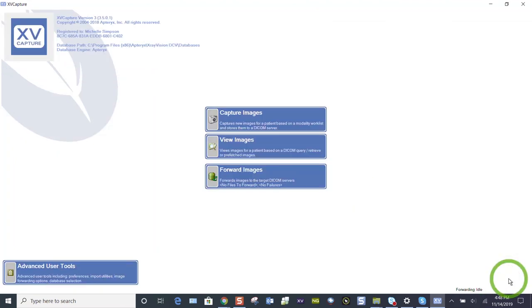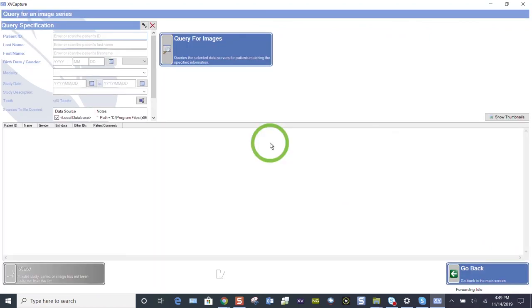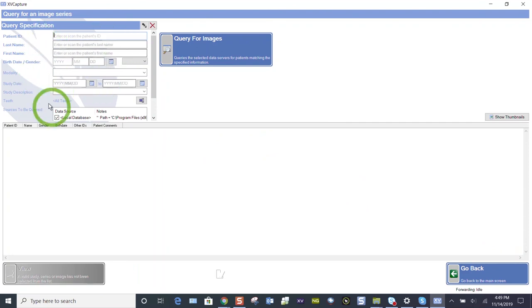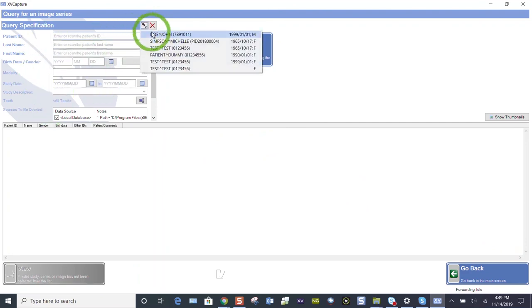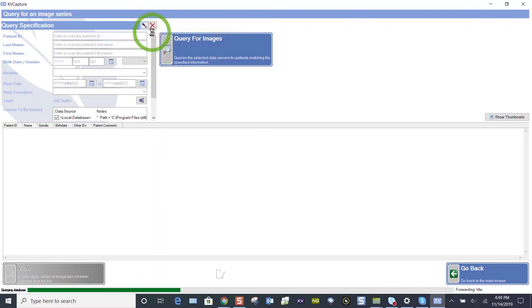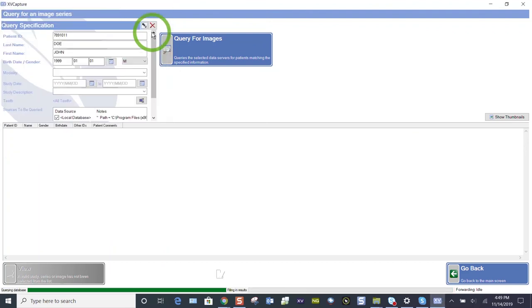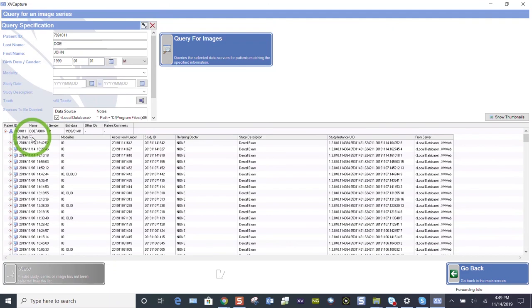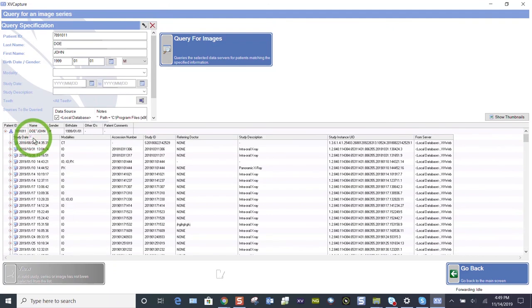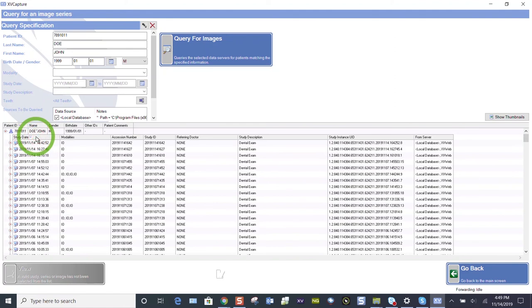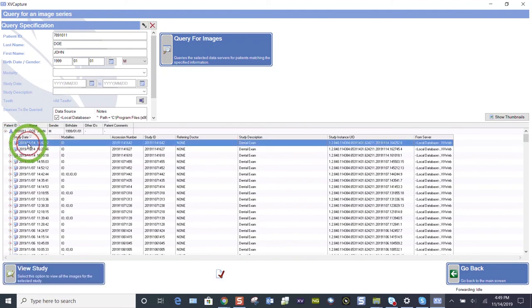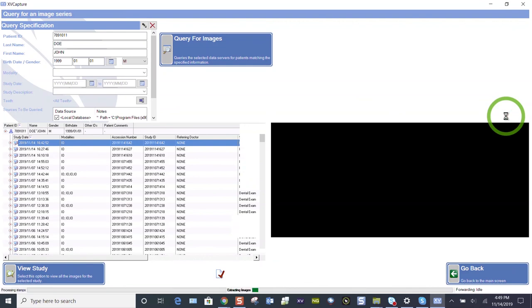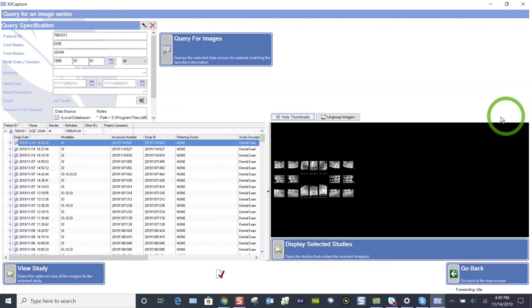I want to show you how to quickly view those FMX 18s we just took. View images. When you bridge over from your practice management software, your patient's name will auto populate. Let's just pull in John Doe. Here's the dates of acquisition. You see the small arrow above study date that rearranges your most recently. Now it's August 22nd. Click that again. I'm on November 14th.